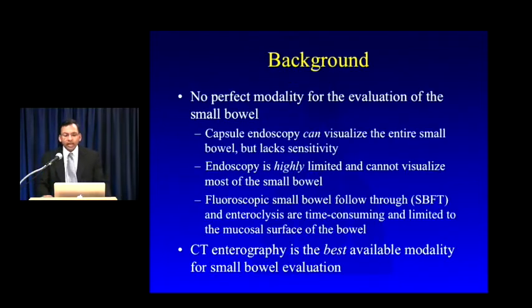Now, it is worth saying, as a brief introduction, that there is no perfect modality for evaluating the small bowel. Yes, some forms of capsule endoscopy can visualize the entire small bowel, but the more you talk to the gastroenterologist, the more you realize that this is a modality that fundamentally lacks some degree of sensitivity. Endoscopy is great if you can see the small bowel, but unfortunately, it's pretty limited in terms of how much of the small bowel you can see. And even though there are forms of endoscopy now, so-called push enteroscopy or push endoscopy, that can see farther into the small bowel than ever before, at the end of the day, you're still not going to be able to see the entire small bowel, and it's a limited modality.